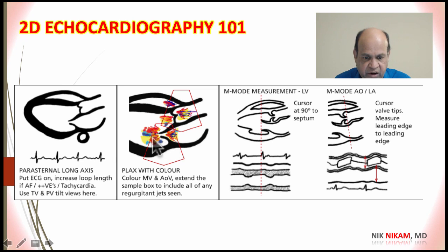This is a color flow Doppler, which will help us to identify the direction of the blood and any evidence of turbulence resulting from either stenosis or regurgitation across the heart valves. And here is the probe going through the left ventricular cavity.